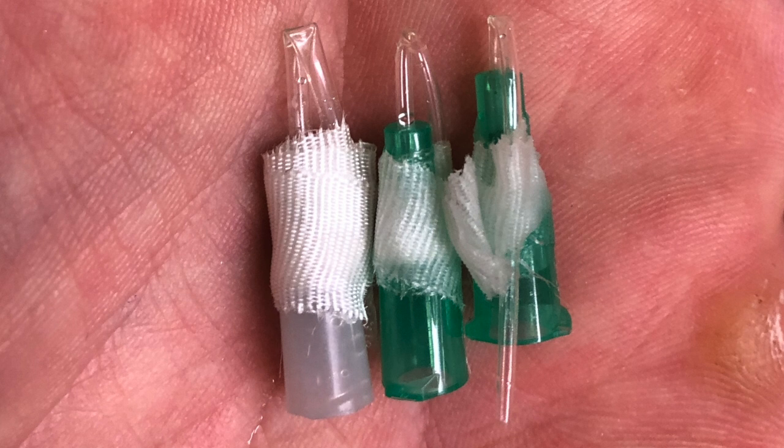It really works. And you don't have to wait until you have a sick patient to make these. Make them ahead of time and keep them handy for your next shift.